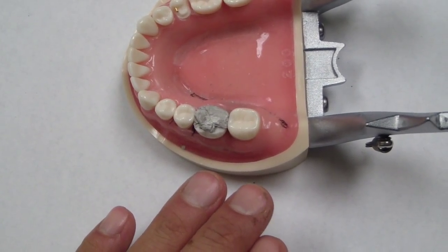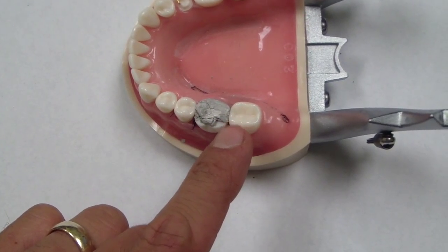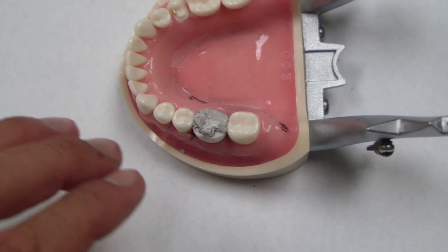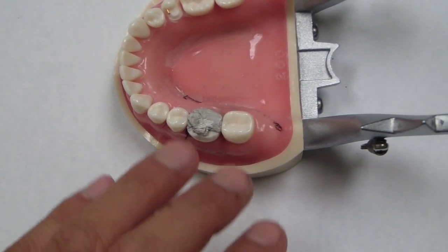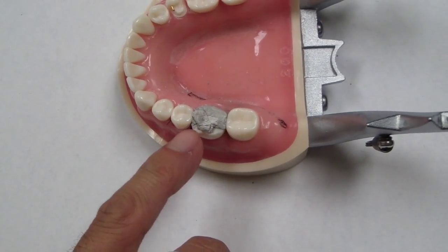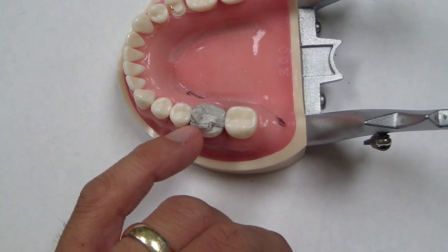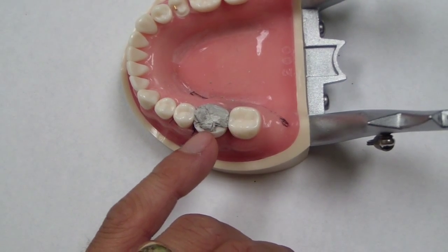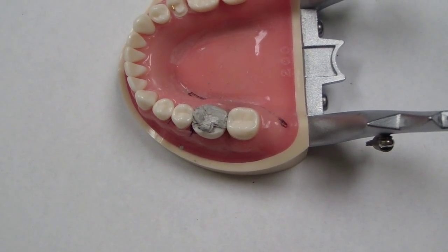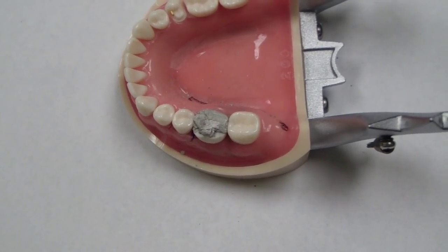One of the first things we're going to do is fabricate a stent — a putty stent, or using a triple tray with some polyvinyl siloxane — to fabricate a provisional restoration using this tooth just like you would for any other crown. You want to make sure the occlusion is correct. You can see here we're missing a piece of this restoration, so we're going to take some flowable and build it up so we have the proper anatomical contours. I'm going to go grab some flowable and place that in there.